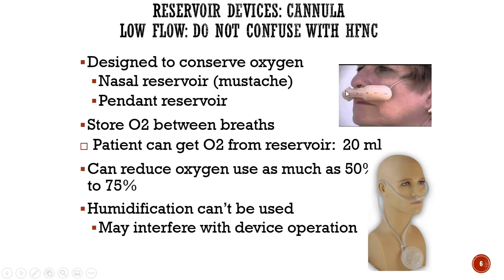But what happens is this area here, if you look at all of this extra room, that's designed to hold oxygen, to build it up as it comes from the flow meter. This is also designed to hold oxygen as it builds up from the flow meter, so that when a patient is breathing in, they're much less likely to dilute as much of that FiO2 with room air, because they have this reservoir here that's trapping 100% oxygen and limiting some of their room air dilution. Still a low flow nasal cannula, guys. I can't stress that enough.